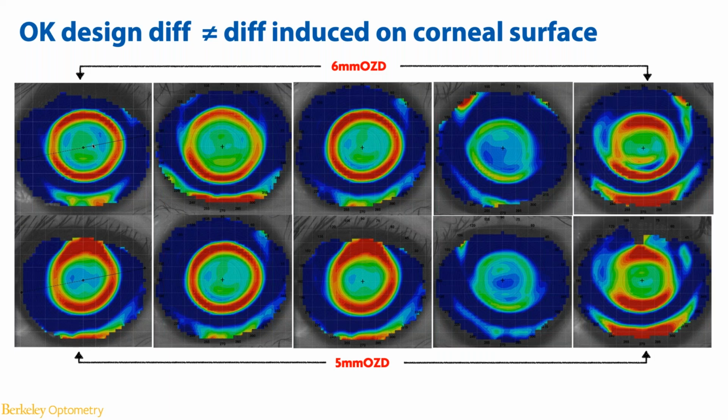Thank you. Yes, it's great to see this from a clinical study perspective because I think if we were to see these results in clinic, we would somewhat panic and think we need to troubleshoot this lens. But every cornea reacts differently to orthokeratology lenses, and understanding that corneal anatomy and morphology is also a very large area of interest in the research field. Exactly.